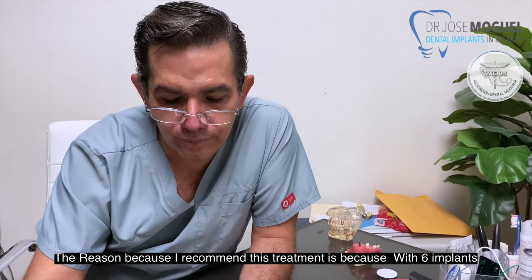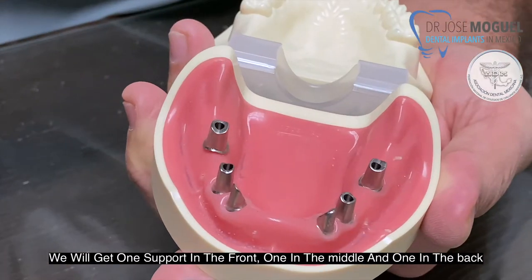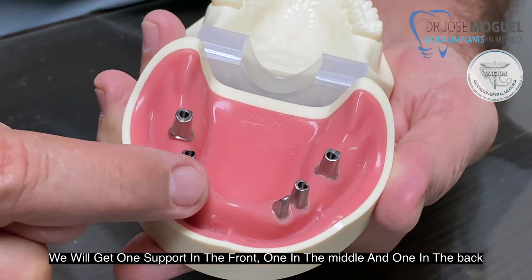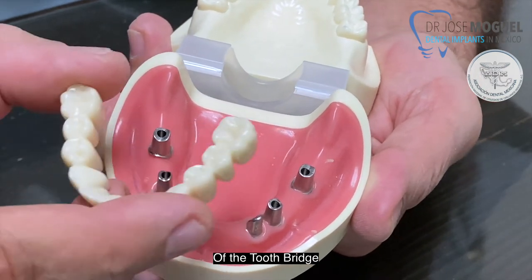The reason I recommend this treatment is because with six implants, we will get one support in the front, one in the middle, and one in the back of the tooth bridge.